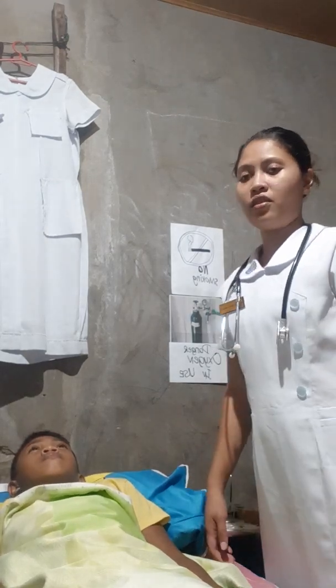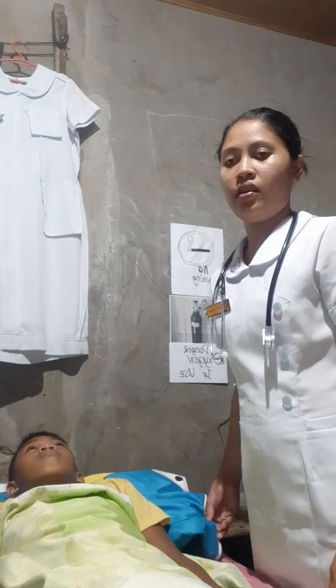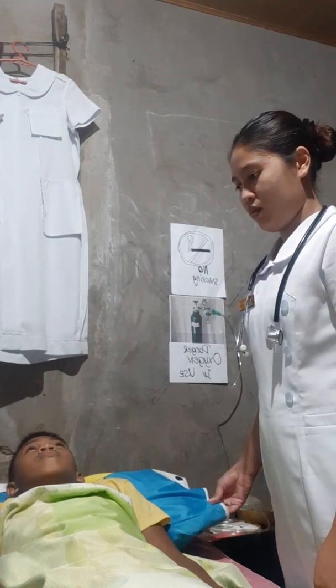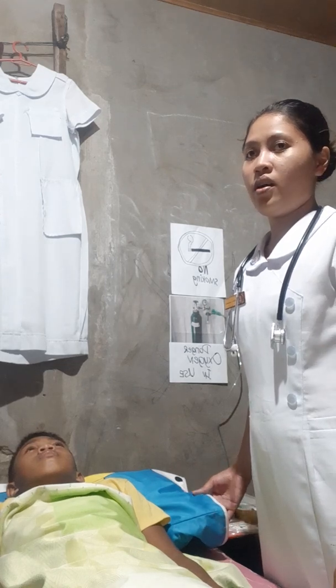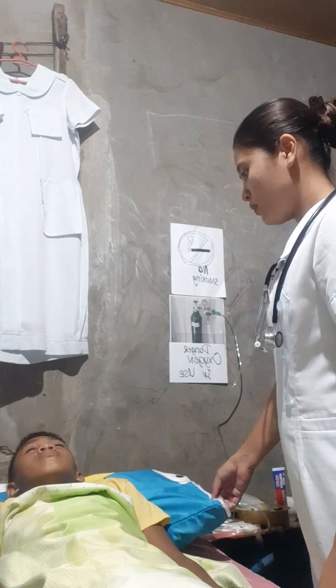Next, introduce self and verify the client's identity and explain the procedure to the client and to the family: what we are going to do, what the procedure entails, and why we are going to do it to the client. So, good day, sir.